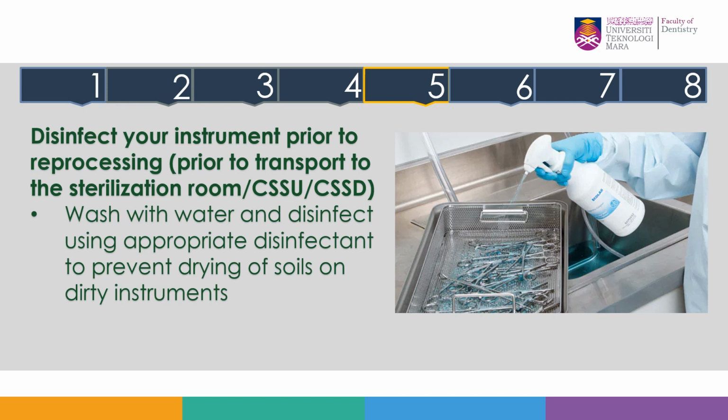Number five, you need to disinfect your instrument prior to reprocessing in the sterilization room or CSSD. There are a few methods available, or based on the manufacturer's recommendation. So most of the method used is to spray after you wash.